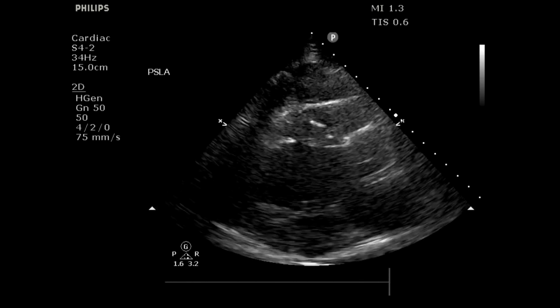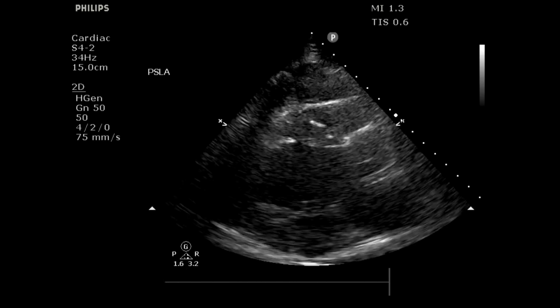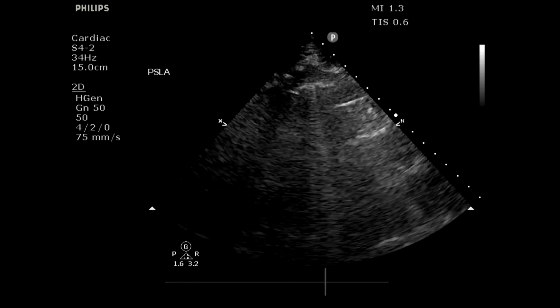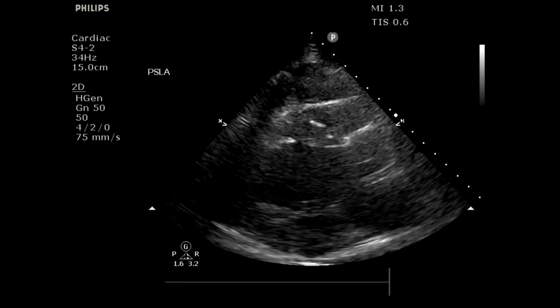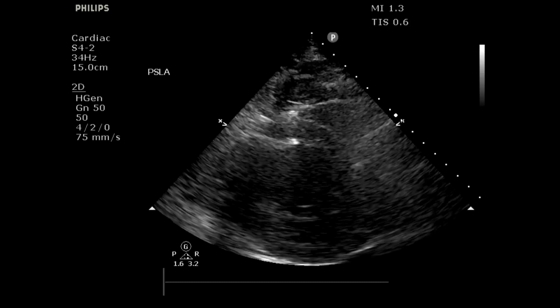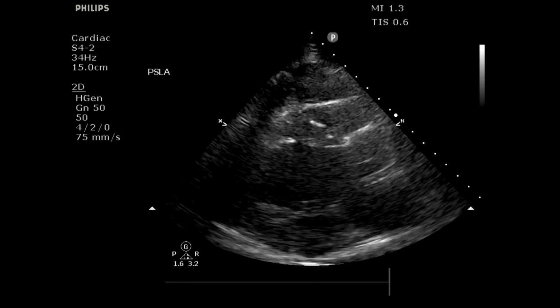So what do we see? We see a lot of B-lines here obscuring the heart. When we look at the heart, we can see that its squeeze is really not all that great. But if we work down our 5 E's, the effusion, the ejection, we don't really have an equality side. We don't see the entrance very well, maybe a little bit of the exit. We can see that there's no effusion, we have a depressed ejection fraction, and the aortic root is not the best window to assess. Well, it is a good window, parasternal long, but we don't have the clearest view, though it doesn't seem to be grossly abnormal.